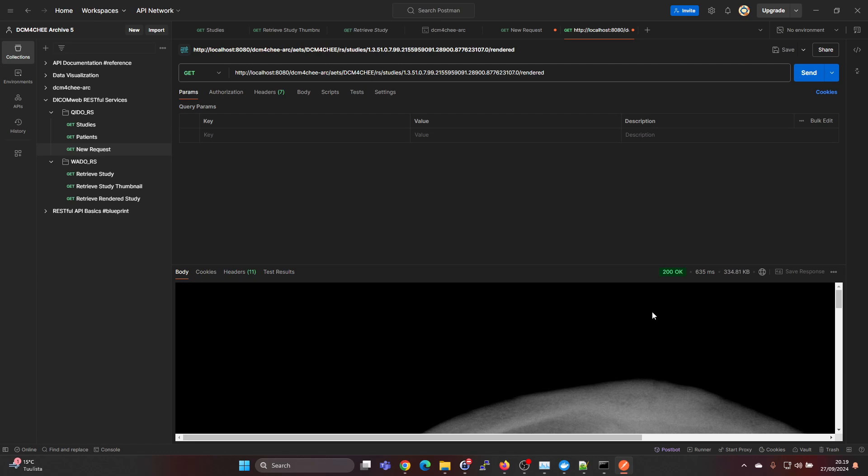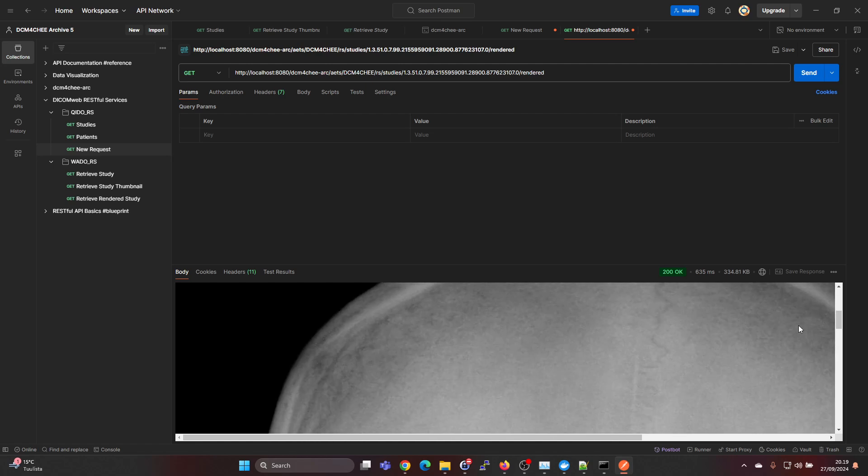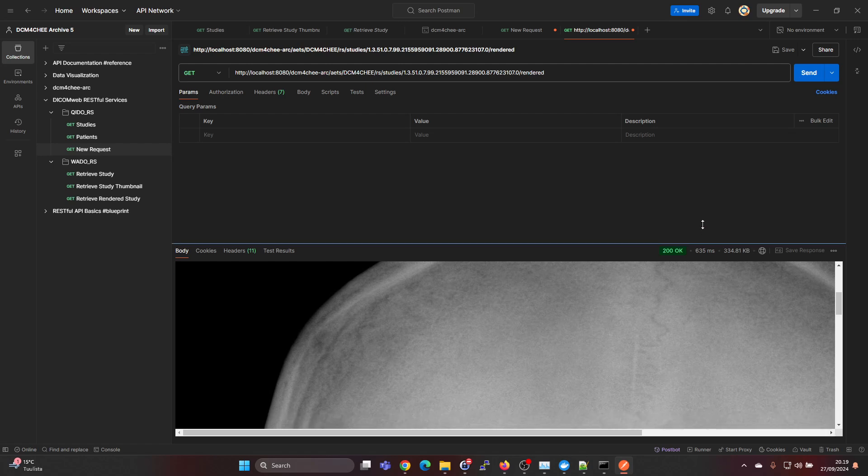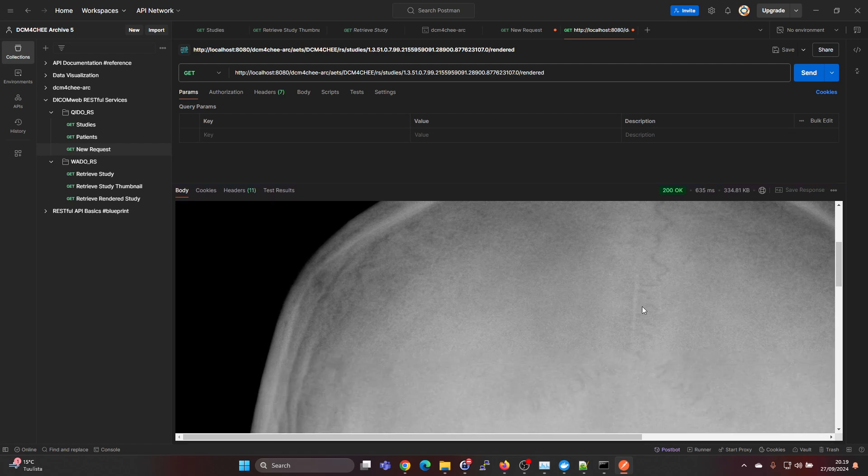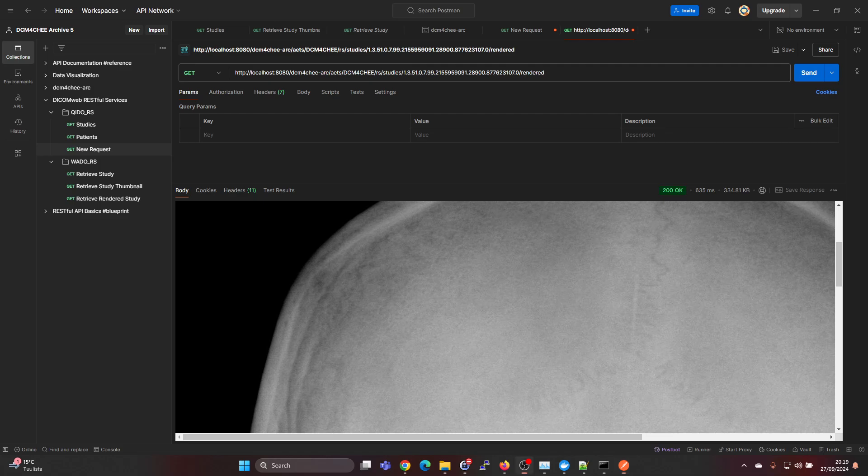If you would want to make a DICOM viewer, or maybe just add capability to visualize images somewhere, and it's a browser app, it would be very easy to just get it in JPEG format and you don't need to have any real DICOM capabilities in the viewer.